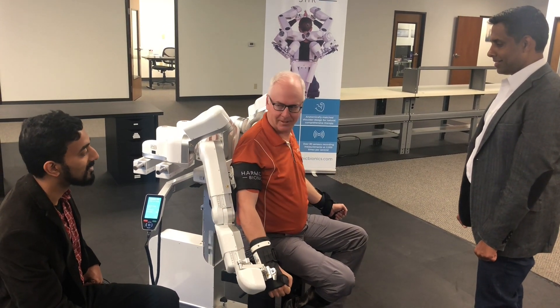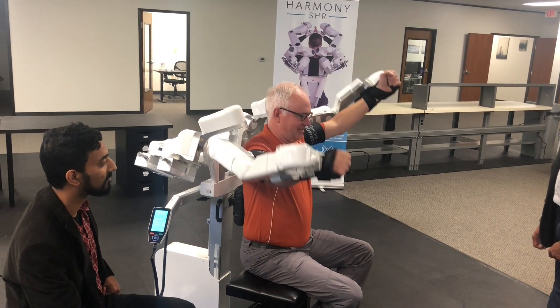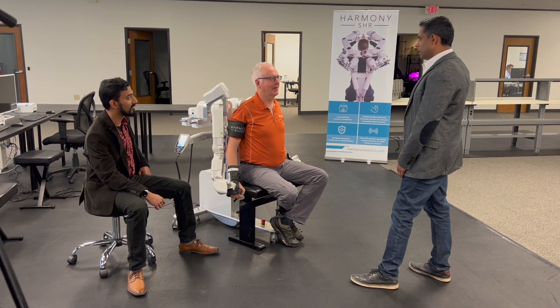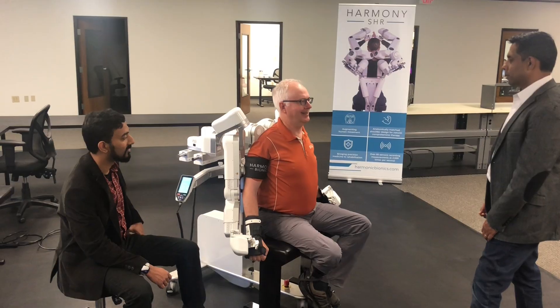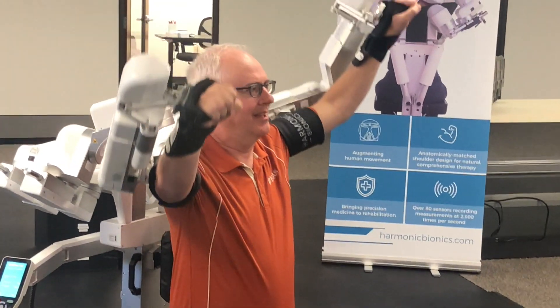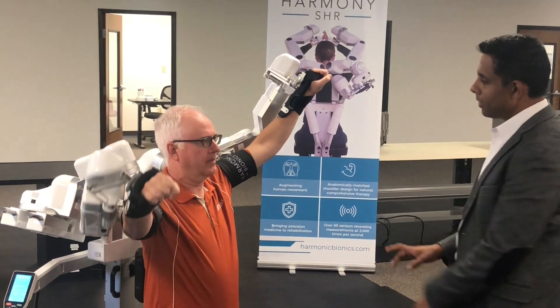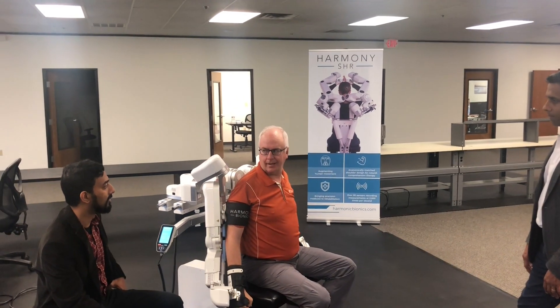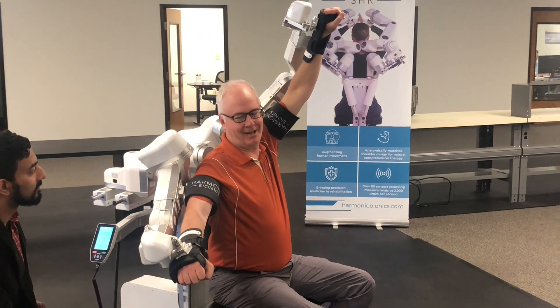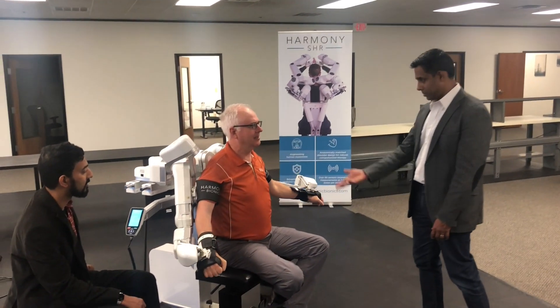Milk the giant cow. That was Scaption. When you're making that phase, to focus on this side, what are you thinking about? I think your movements look smooth. They're not perfectly matched — that's by design, but they look fairly smooth. The idea is to ensure that you still have to put in the effort. It's not a free drive. It's not completely mirror mode because I'm not putting any effort in over here.